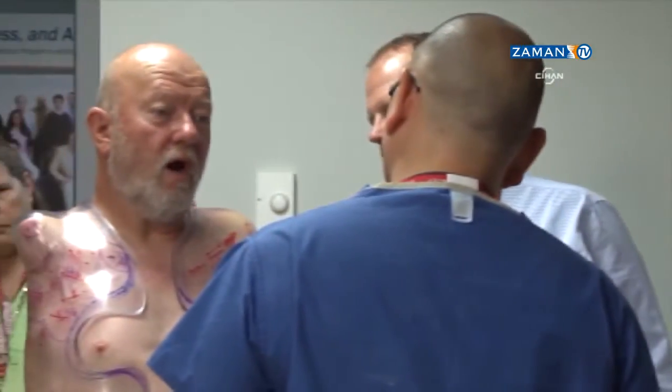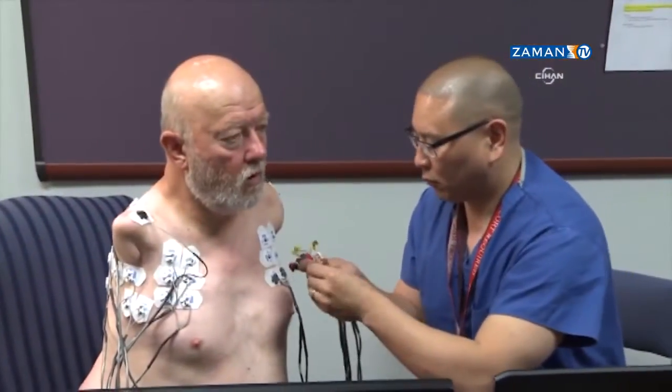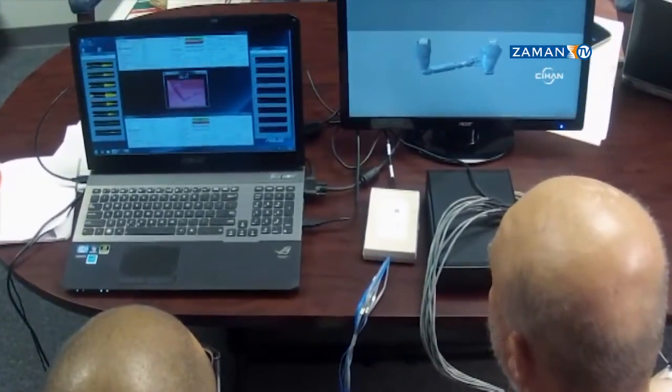This old school approach is working out so much better than the modern. While the socket got its finishing touches, the team took the next step and had Les work with the virtual reality system that mimics the actual prosthetic arms.